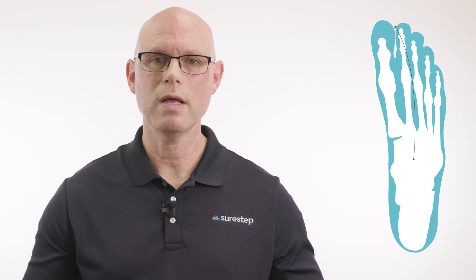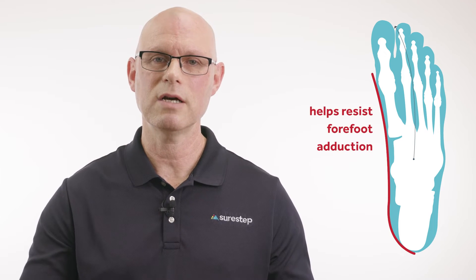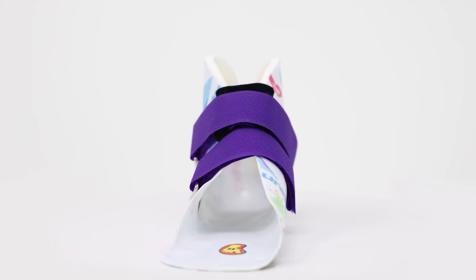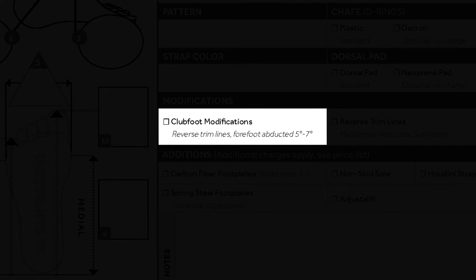The reason you would use the reverse trim line is if a child has forefoot adduction — you'd want that long medial wall to help resist the adduction of their forefoot. For the clubfoot modification, we extend that medial wall out past the first metatarsal head and bring the lateral wall proximal to the fifth, but we also create a modification in the mold. On the order form, it specifies five to seven degrees of abduction, so with that modification we're actually addressing the foot deformity, not just the forefoot.